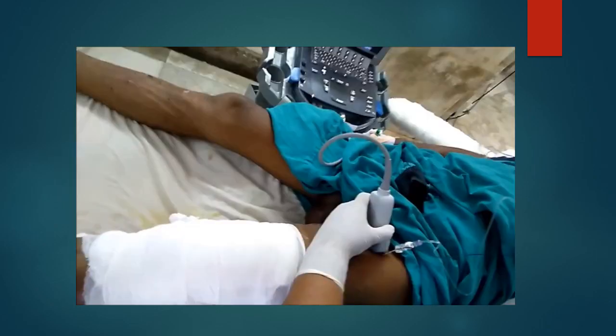The anterior approach to the sciatic nerve block is performed with the patient in the supine position. The hip is abducted to facilitate transducer and needle placement. When feasible, the hip and knee should be somewhat flexed to facilitate exposure. For nerve stimulation, exposure of the calf and foot are required to observe motor responses.